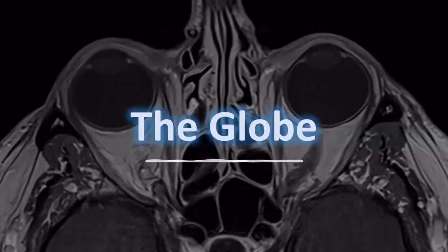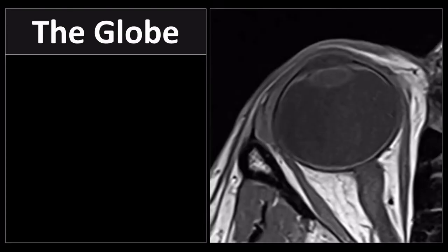Hello, and welcome to this second presentation on anatomy and pathology of the eye, orbits, and visual system. In this presentation, we're going to talk very specifically about anatomy and pathology of the eyeball or the globe. Let's start with some anatomy.